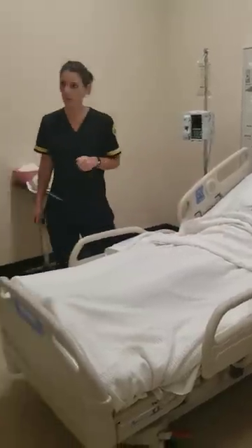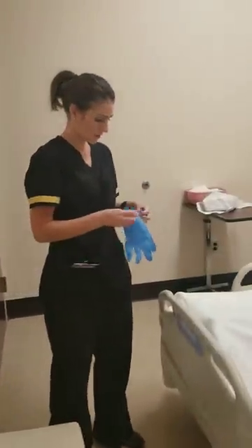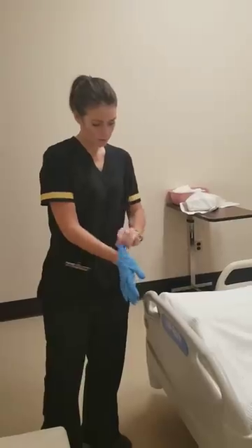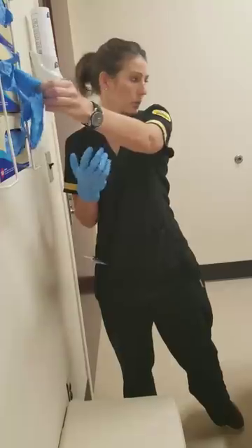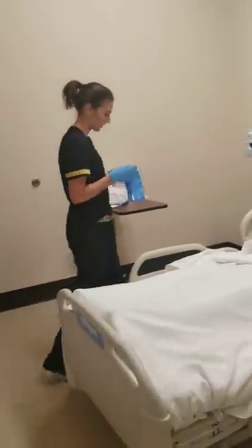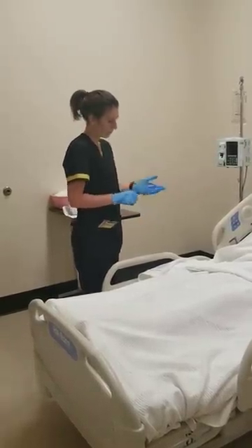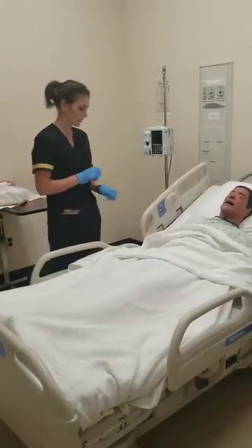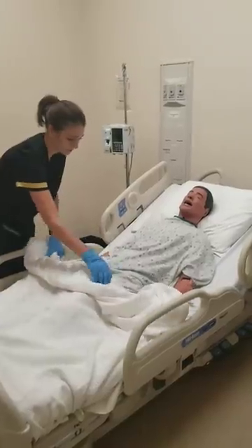Go ahead and get me some gloves on, and we're going to run some perineal care. Your doctor ordered a Foley catheter because you're unable to void on your own. It's a quick procedure. We have to place a catheter in your urethra to your bladder to drain it. Before we get started, do you have any allergies to betadine, iodine, or latex? No? All right, I'll try to maintain as much privacy as I can.